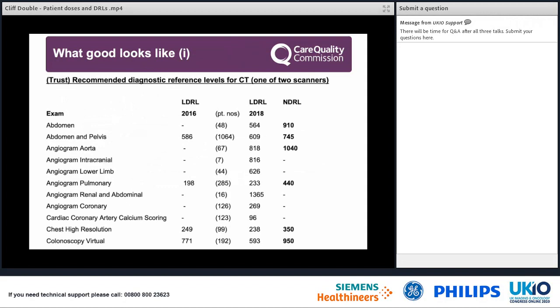The final remaining two slides give, I've called them good examples of how we've seen DRLs being presented. Other good ways of presenting DRLs are available. So we've got two slides here. This is the first one for CT. Take a little note to scan through the information that's there. Quickly down the examinations, this is just the first top quarter or so of a very extensive list.